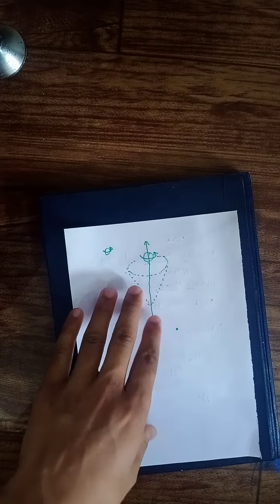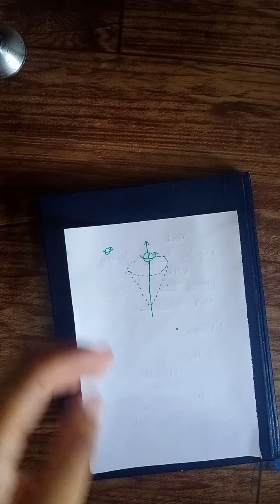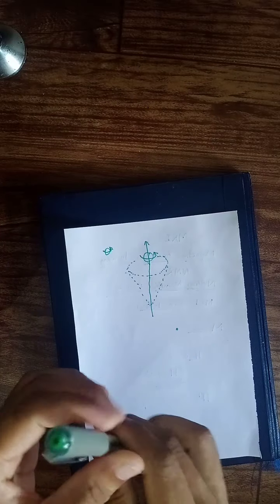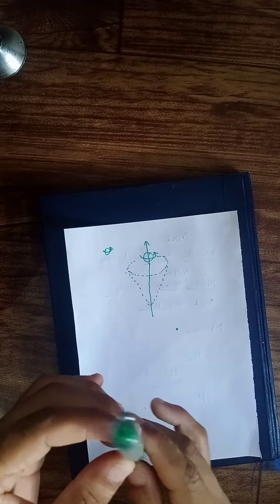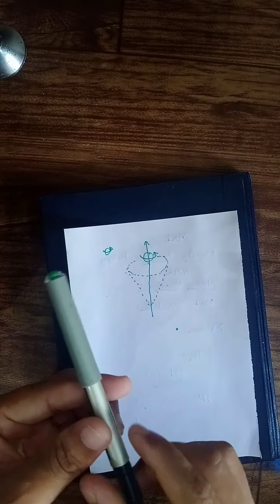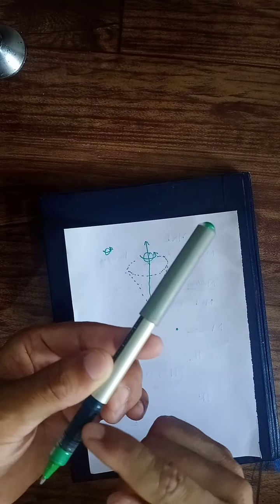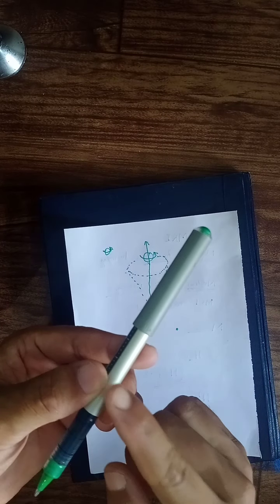Spin and precession will help you discuss more about the detailing of the proton. Let me give you an example. If a current passes through a conductor, what happens?